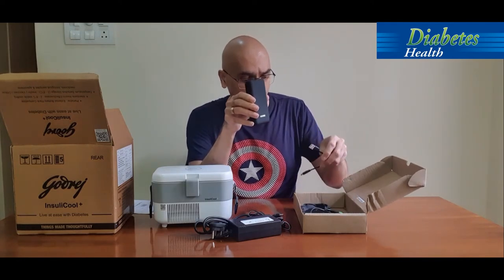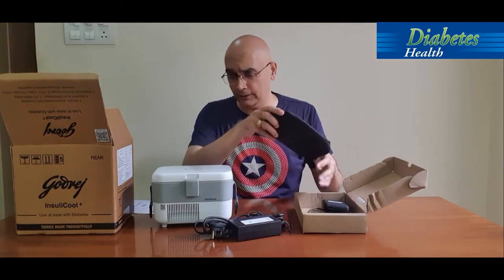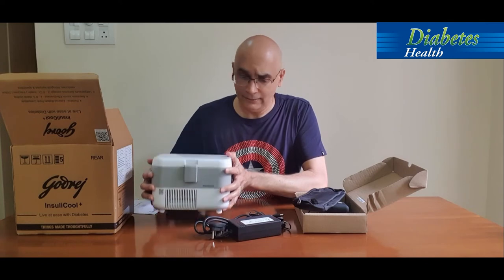There's also a 20,000 mAh power bank provided, along with cables including a car adapter cable. If you're traveling on the road, you can directly charge the unit from your car adapter. When that's not possible, the power bank comes in handy — it gives you about four hours of power supply to keep the unit going, so we can safely travel anywhere with this lightweight device.